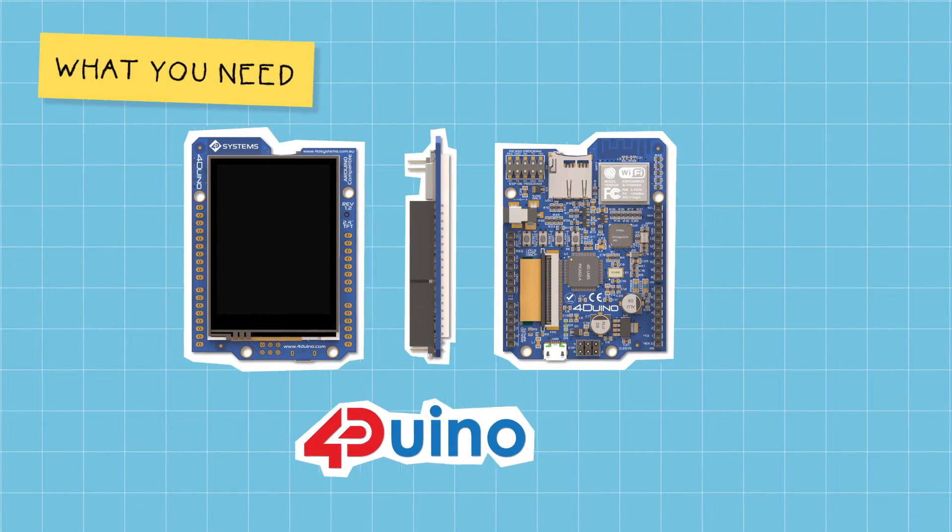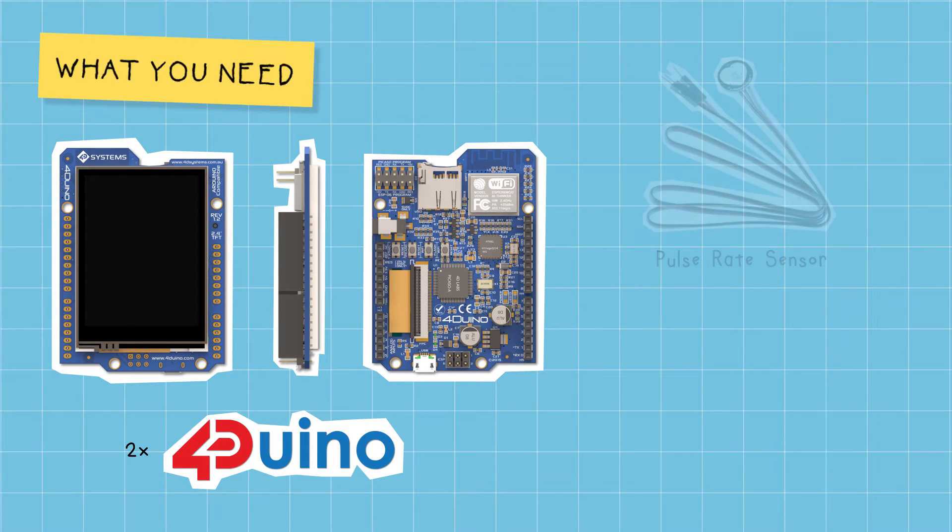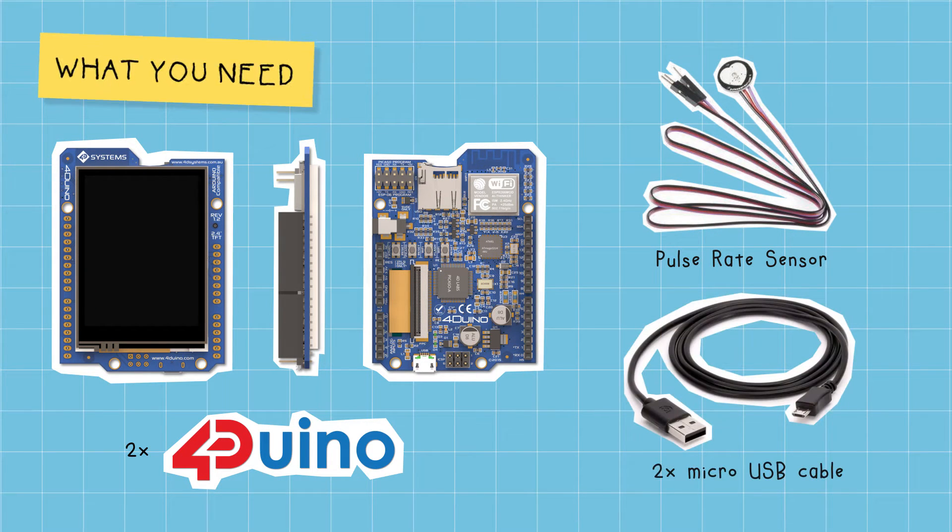To build the project, all we need are two FORDUINO modules, a pulse rate sensor, and two micro-USB programming cables.